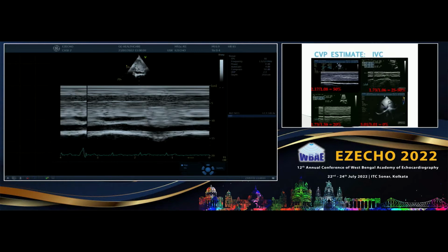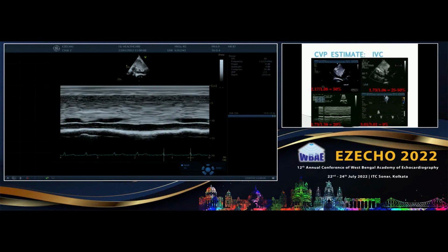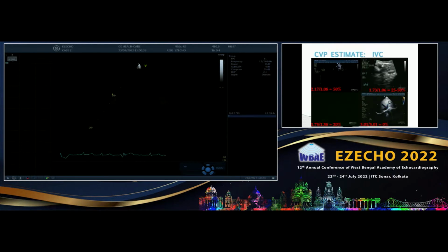Now, you had a question about the cutoff. It is now turned to 1.7. 2.1 is for the European population, and in Indians, we have also seen it is at a lower level. So go for 1.7. Athletes, especially swimmers, have large IVCs, so there you give some concession up to 21 millimeters. Very competitive swimmers have very big IVCs, and they even have slightly bigger RA and RV chambers. But those will be collapsible, though they are very big.